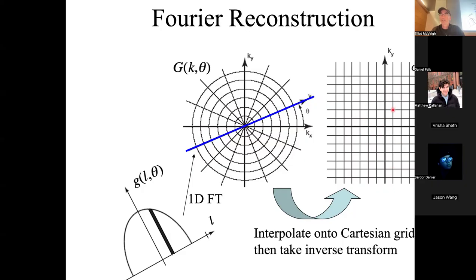So for any point on this grid, say here, I go back here to that same point and ask, how can I estimate what my value is there from the values around it that I have actually measured? So that's just an interpolation problem. You just pick a point here and say, well, from my data, what can I tell you about this point here? Some of those points you have, right? So this one here, I do have, like here. We have exactly the point, but other points on the Cartesian grid you don't have.